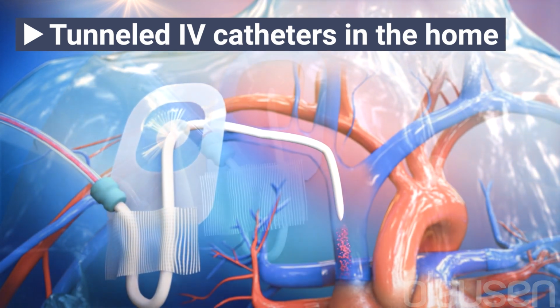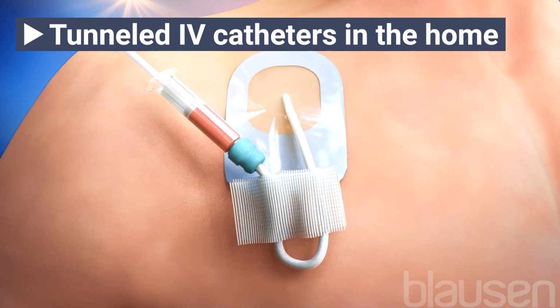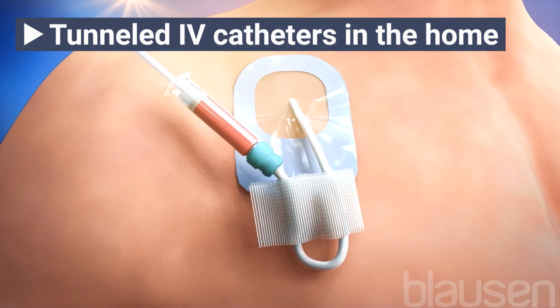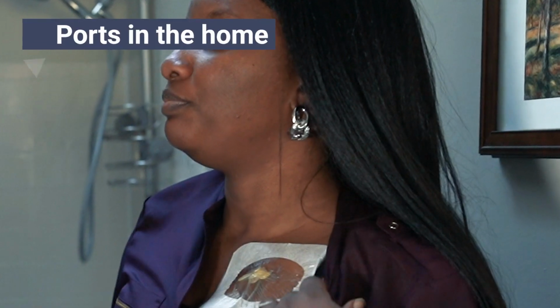The catheter also has a special cuff under your skin so that your tissue can grow around the tunneled central venous catheter, holding it in place. Up to 8 inches of the tunneled central venous catheter are inside the skin and in the vein, but only a few inches are outside the skin. Tunneled central venous catheters can stay in place for many months up to years. Most medications can be given in a tunneled central venous catheter.